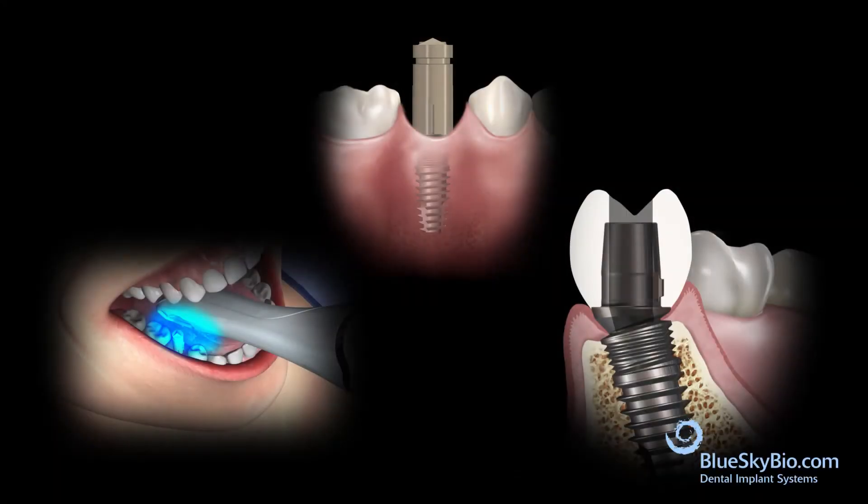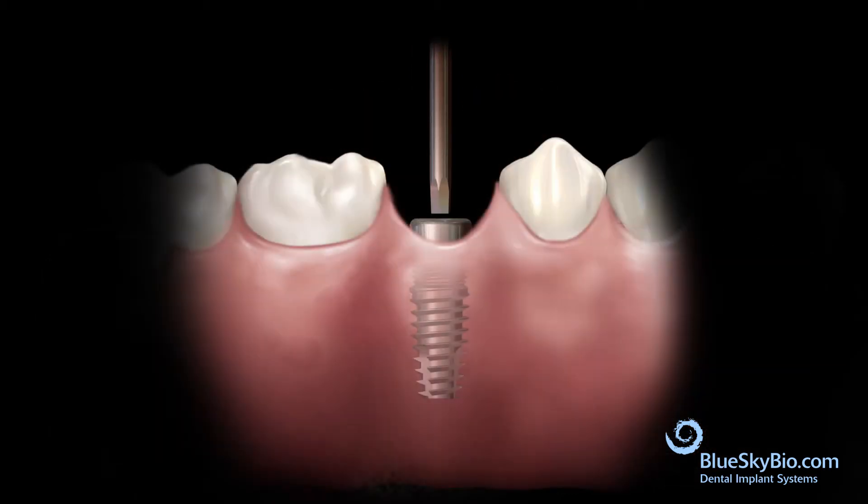This video shows how to make a screw-retained ceramic restoration on a titanium angled base abutment, utilizing the Rosetta component, which is a universal optical scan body adapter and healing abutment.